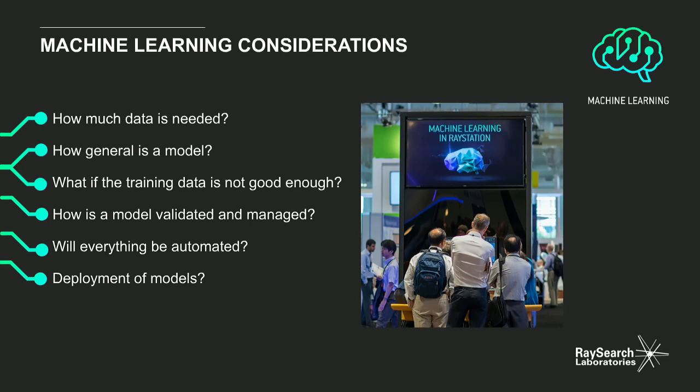What if the training data is not good enough? Bad training data will affect the performance negatively, although there are tricks we can use to improve the model and detect bad training data. Basically, training a model requires some knowledge and skills.